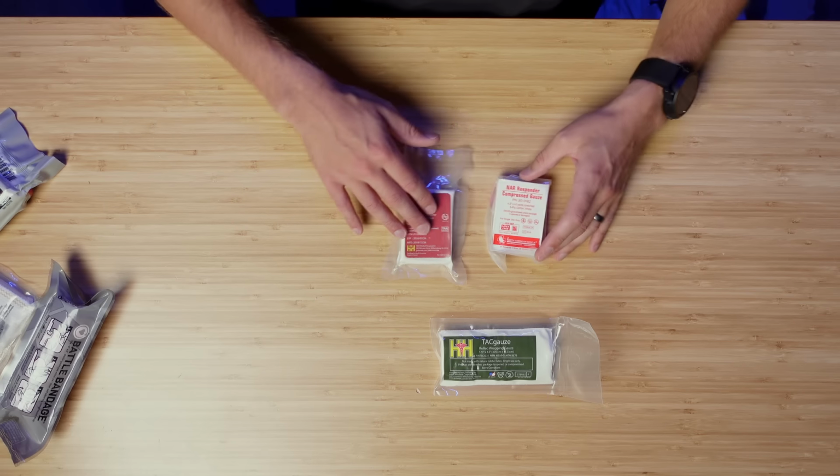If you can get away with it and if you're okay with the potential exposure for your gauze, I personally like opening it from that outer packaging. Just be aware that will completely diminish any sterility that this once had. So just keep that in mind, and obviously you're assuming your own risk by damaging packaging or taking it out of that packaging beforehand. All right, so let's talk about some of this stuff here.